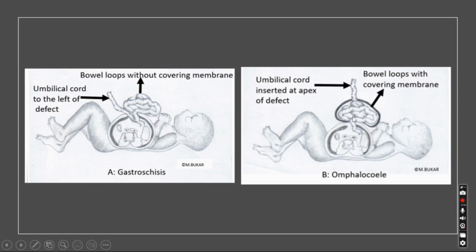There are certain conditions that should be met before a pathologic diagnosis is made around the 11th week of gestation. One is when the liver herniates into the defect. Two is the defect is greater than 7 millimeters. And three, if the amount of herniation is greater than or equal to the diameter of the abdomen. Under such circumstances, the diagnosis of an omphalocele can be made.